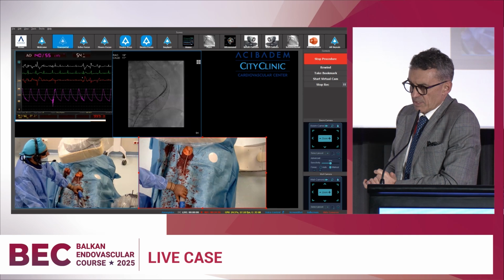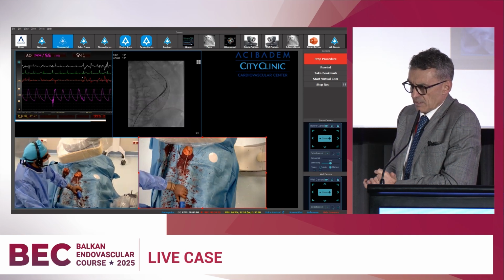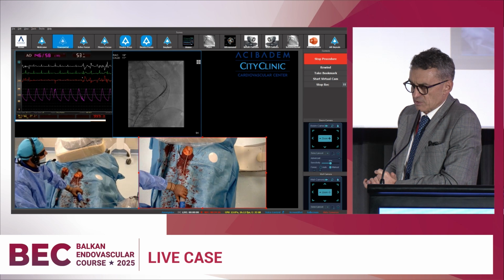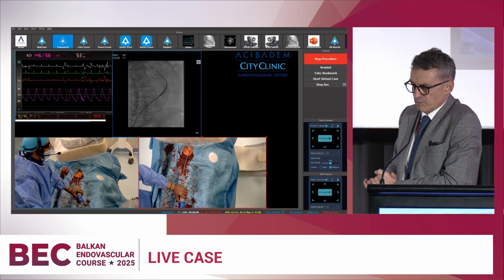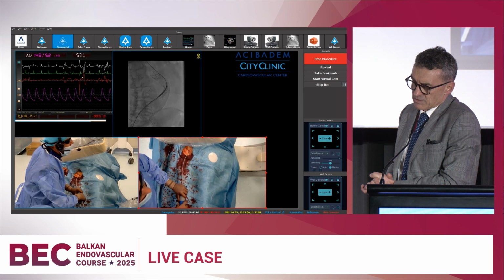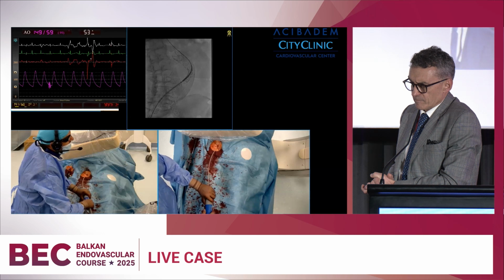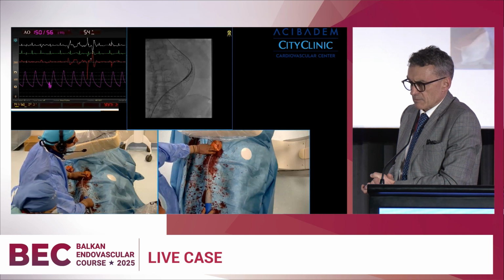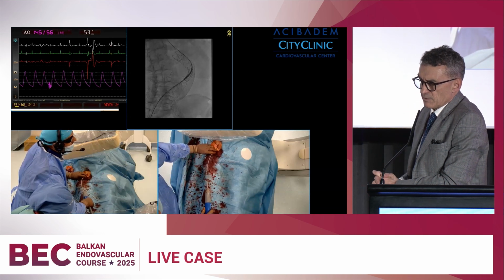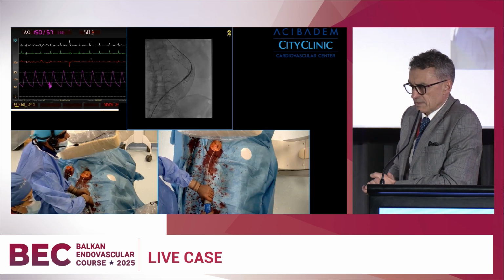And you remember the huge endoleak, and it's possibly 2 centimeters inside the proximal and 2 centimeters inside the distal stent, more or less. From this point of view, it's in the perfect position, I think. Any comments? It's excellent. I think that the gap is just in the middle of the new stent.